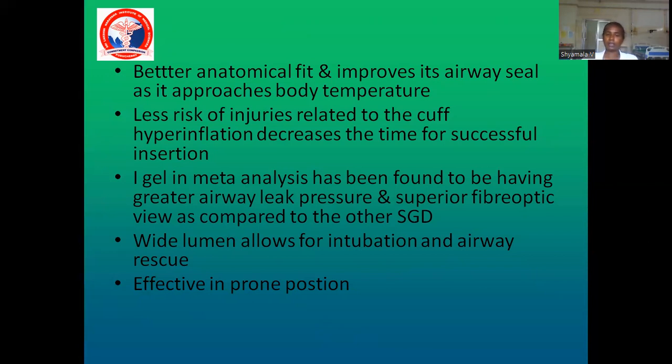In meta-analysis, the I-Gel was found to have a greater airway leak pressure and a superior fiber optic view compared to other supraglottic airways. The wide lumen allows for intubation and also airway rescue. It is effective even in the prone position because it is made of that thermoplastic elastomer, which fits into the airway.